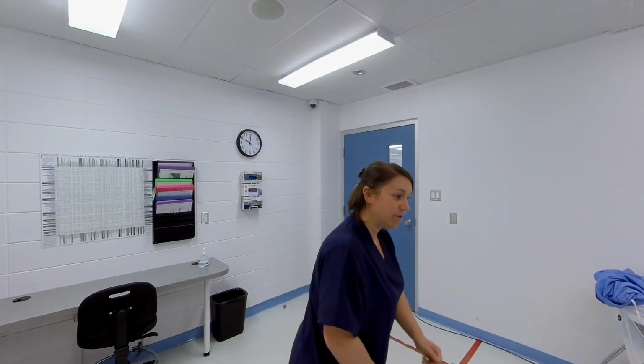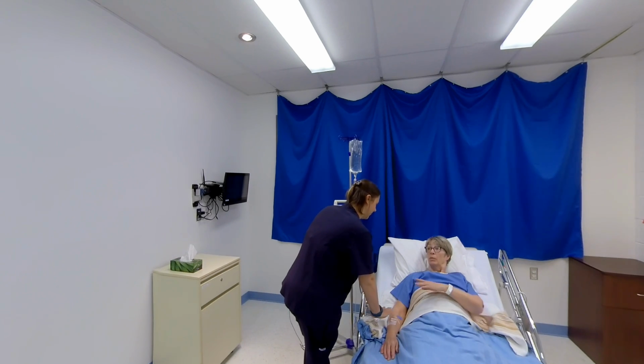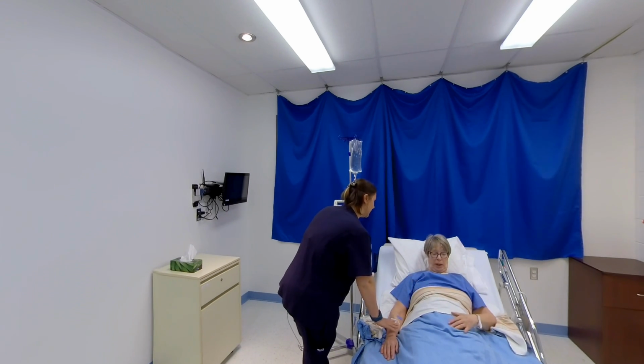All right, the nurse is gonna come and see you. So we're gonna get up, okay, and have a walk. Oh, okay. Well, when you get up, just be careful not to pinch or snag the tube, okay? Okay. Perfect. But you're going to stay close. I will stay close. Okay.